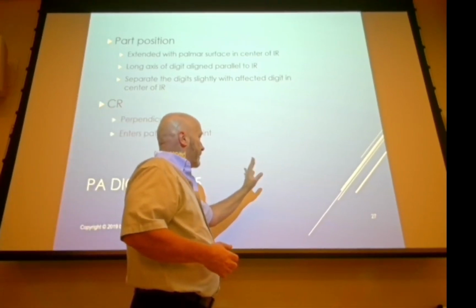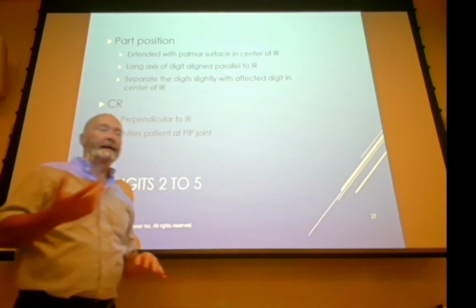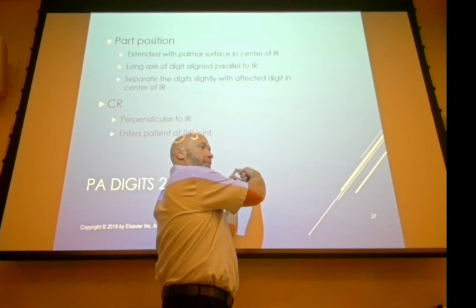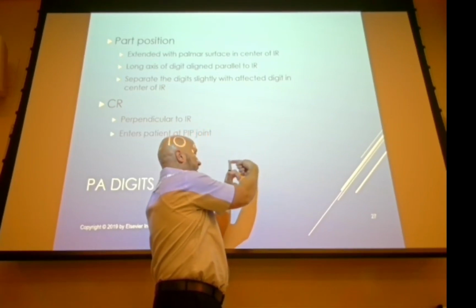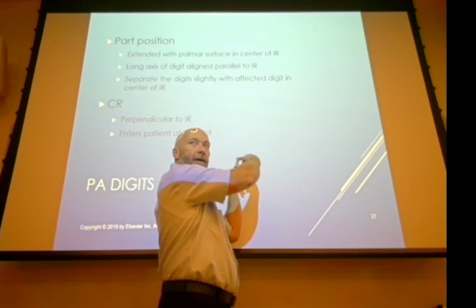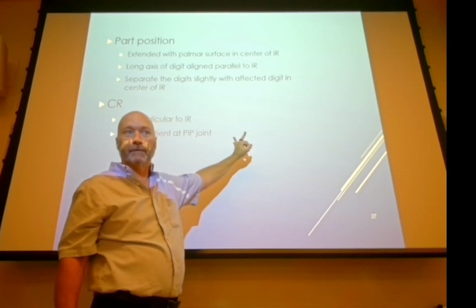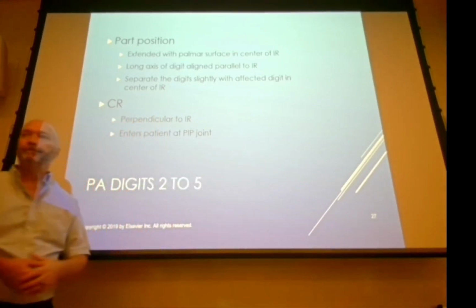And you might have some difficulty getting the fingers bent so that you can see the individual fingers. So the textbook recommends you take maybe a tongue depressor, like if you need to see the ring finger, take the tongue depressor and push it like that. So if you've got a broken finger and somebody's asking you to push a finger like that, what's your answer? Yeah, get bent, right? So no, I'm not. But you can do other things. You can extend your pinky finger and it'll kind of drag that finger with it, right? So you can do other things to make it happen.